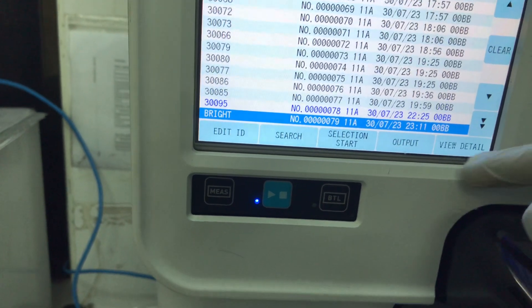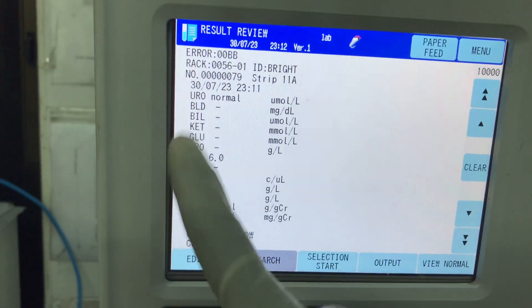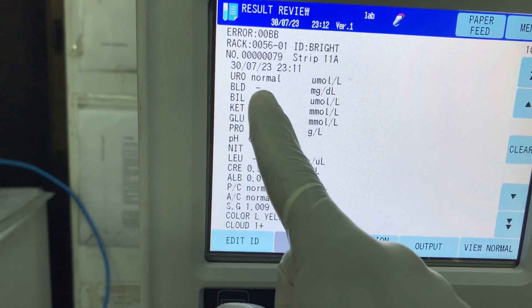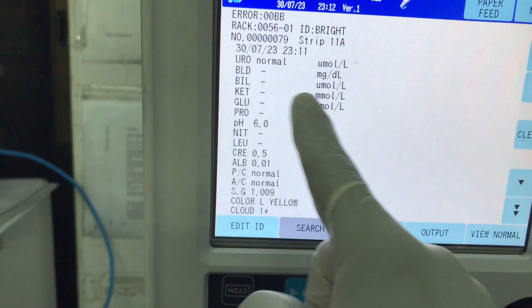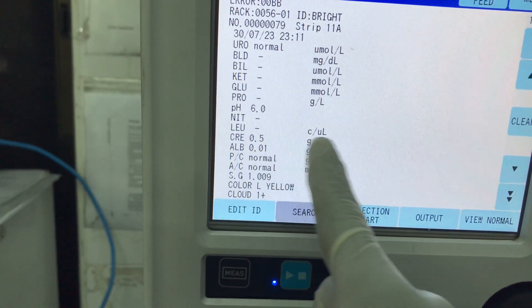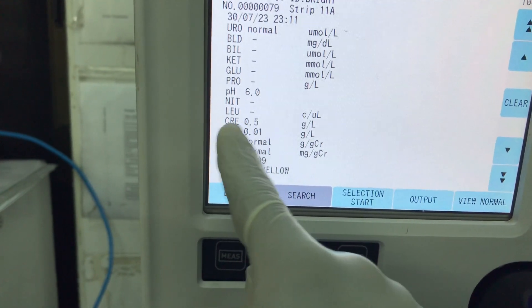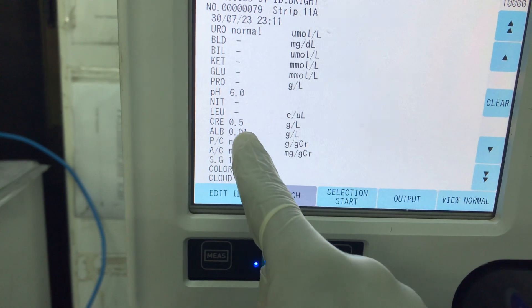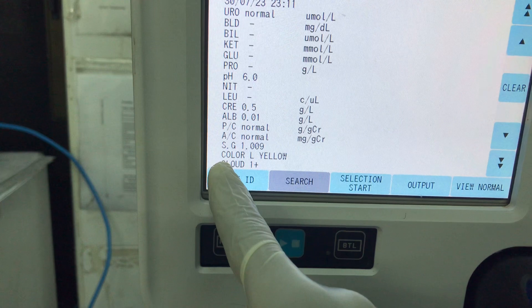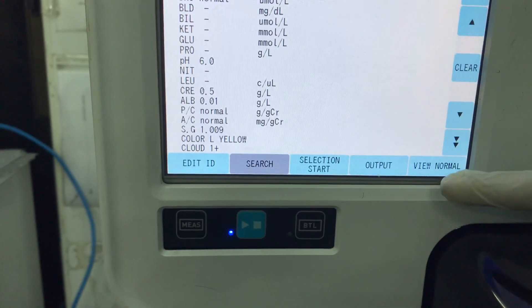From here you can view the results. That's the results. It gives you the color — which is normal — and also the quantitative value. Blood is negative, so there will be no value. Then bilirubin, then ketones and glucose, then the pH, then nitrite, then leukocytes. Then we have the urine creatinine, the urine albumin — that's 0.01 gram per liter — and so on and so forth. That's the specific gravity, that's the color, and so on.